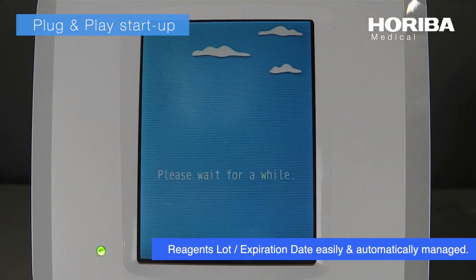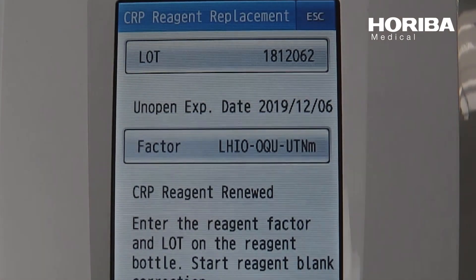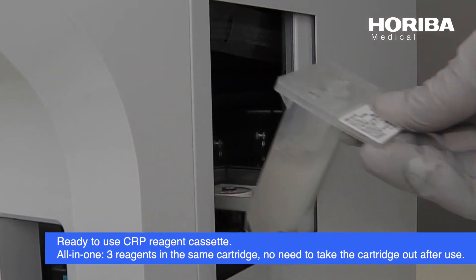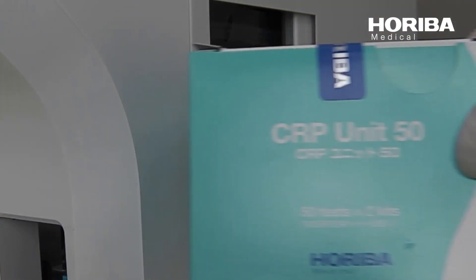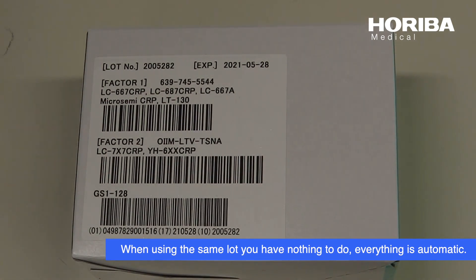Reagents lot, expiration date easily and automatically managed. The Ingenious CRP cassette and the Microsemi CRP fridge allows the reagent to be available and stable in the system 24 hours a day. When using the same lot, you have nothing to do — everything is automatic.